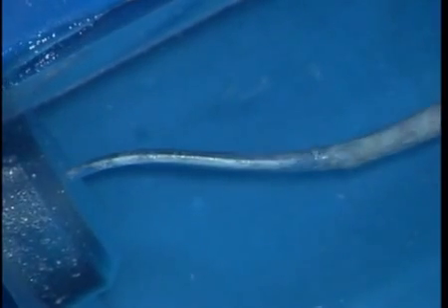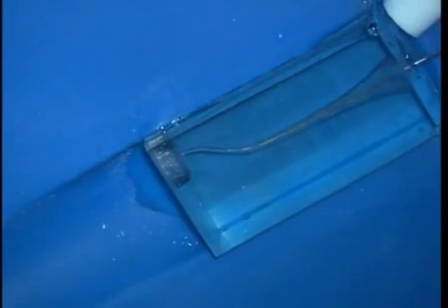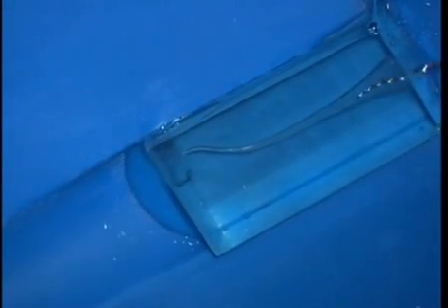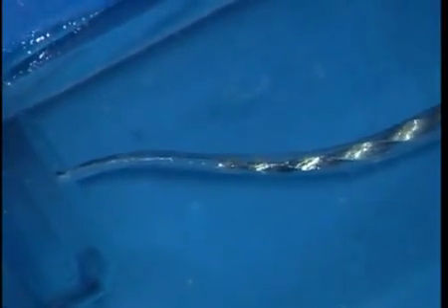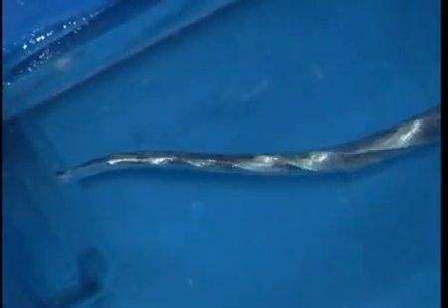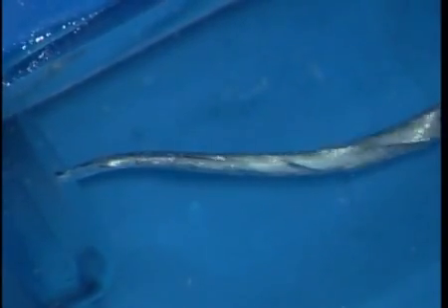This instrument is worked until it achieves length. After every greater tapered instrument, irrigate, recapitulate, and re-irrigate. Here we use the Finisher number 1. Notice again that it's pre-curved, and the pre-curved instrument readily bypasses the ledge. This instrument has a 7% taper in its apical extent, and because of this taper, it very nicely can refine and smooth and eliminate the ledge in its entirety.